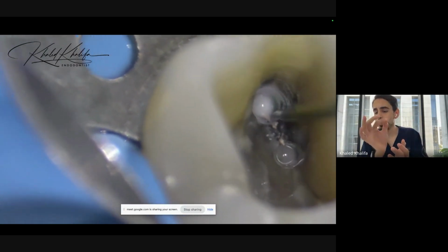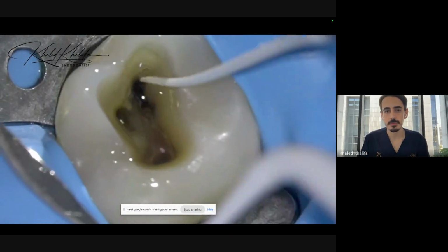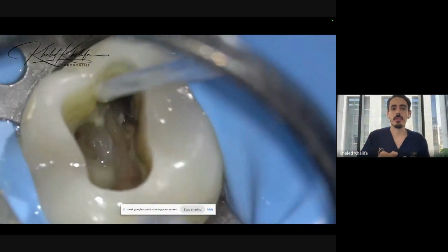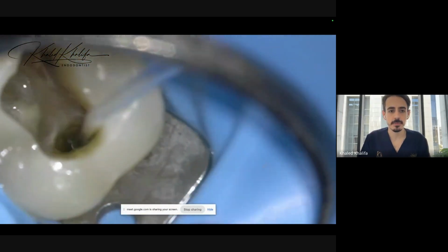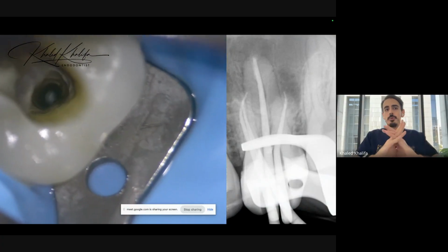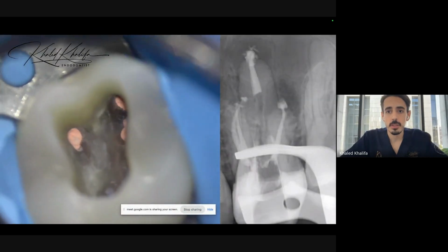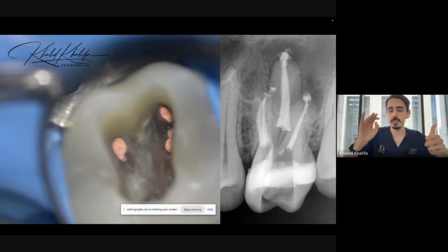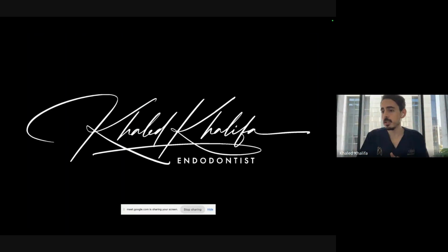And I'm removing the excess gutta-percha from the isthmus between the MB1 and MB2. And I'm doing sonic activation and intracanal heating. And now I'm doing microsuction inside the canal. And I'm gonna start the obturation. This is the master cone X-ray to make sure everything is good. I did single cone obturation for the MB1, MB2, and distobuccal, and for the palatal canal, because it's big, I did hot modified technique. So I combined two obturation techniques in one case.